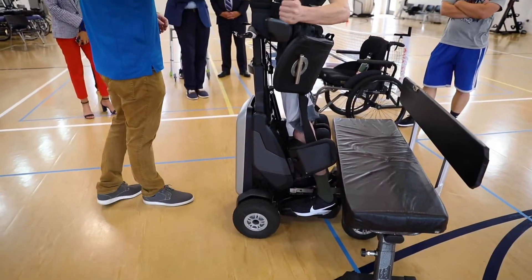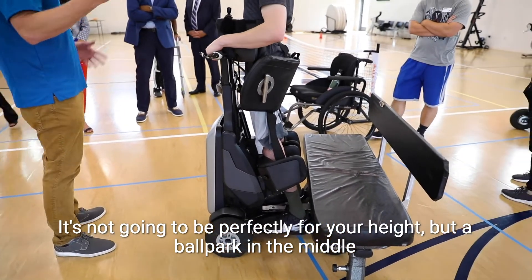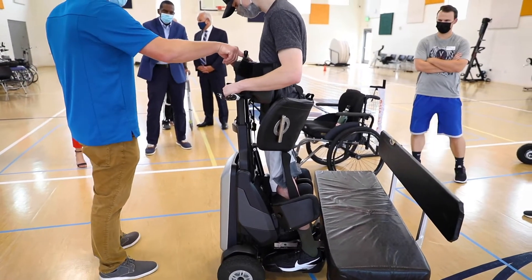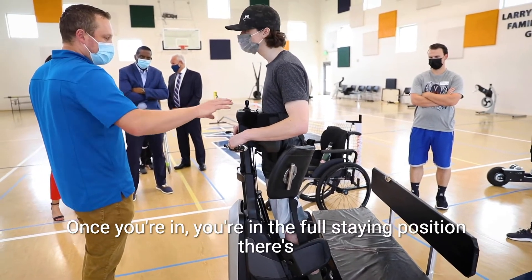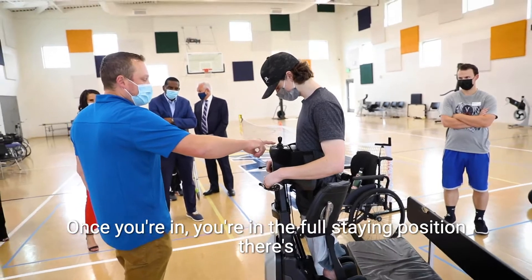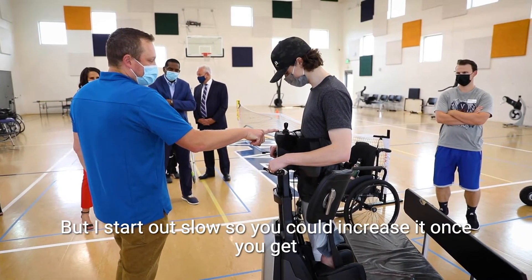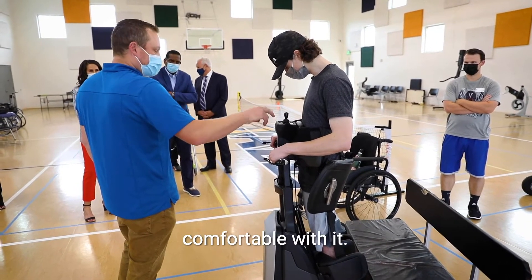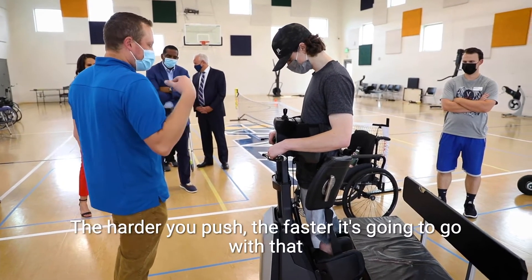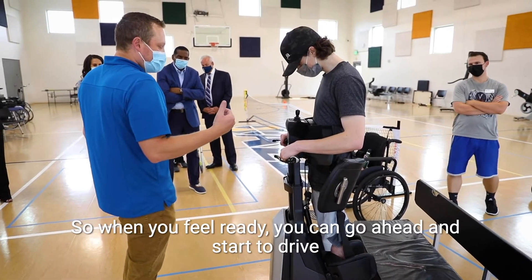This is in demo mode, so it's not going to be set up perfectly for your height, but it's kind of ballpark in the middle. Once you're in the full standing position, there are adjustable speeds, but I start it out slow. You could increase it once you get comfortable. The harder you push, the faster it's going to go within that speed control.